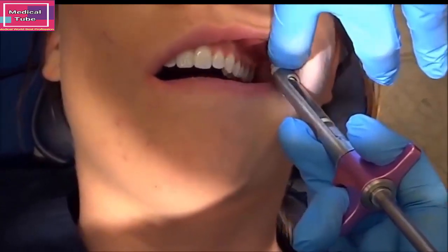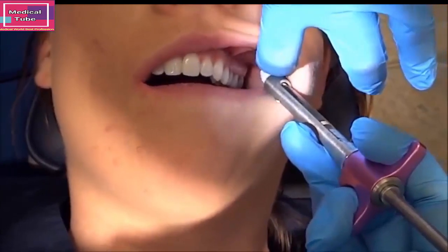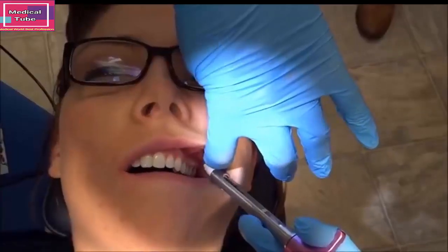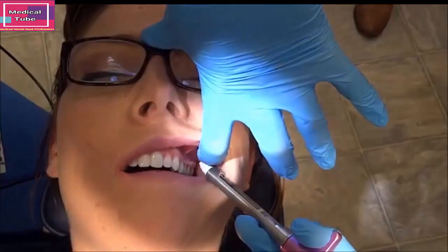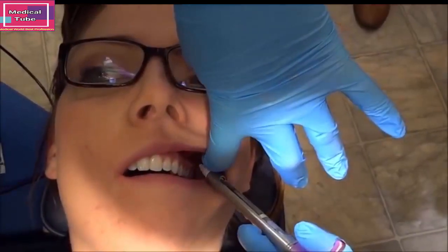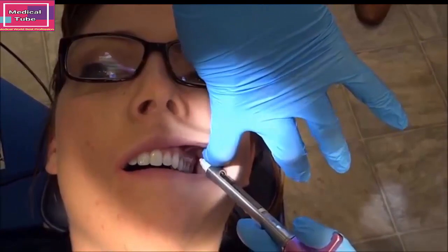Now a lot of times people will have this index finger in the way, so as you go out, you want to move that finger forward. And now as you can see, I'm in line with the nose and that opposite eyebrow up here. Then you'll aspirate and you'll deposit about 1/2 of the carpule for your periodontal debridement procedures.